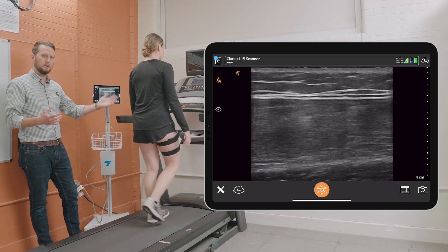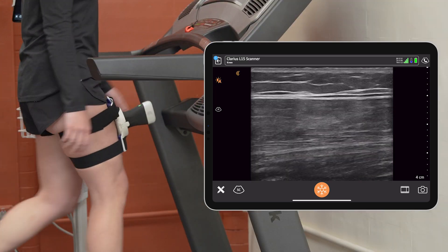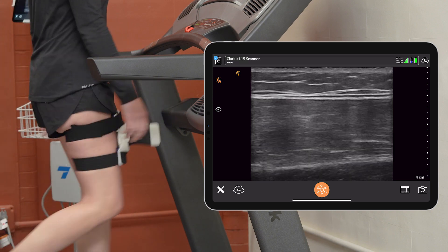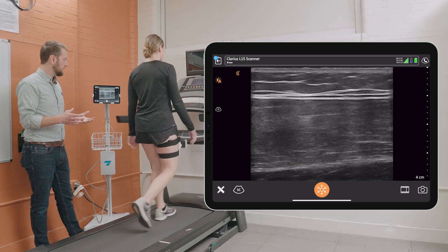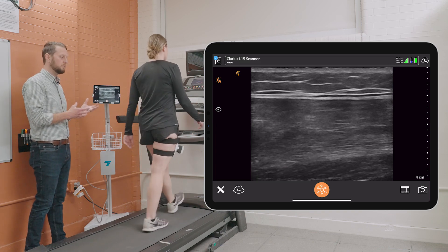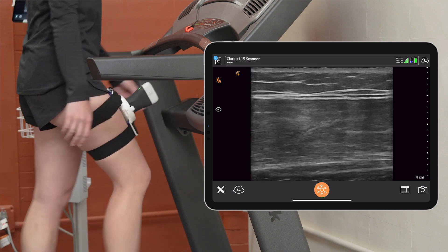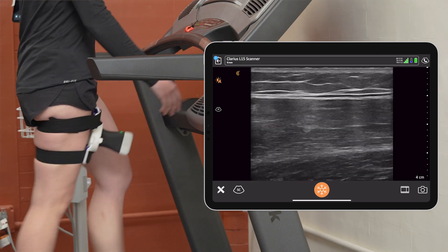We're having her walk on the treadmill, and what you can see in our ultrasound image is again our skin up top, our subcutaneous fat, and then our rectus femoris muscle lying underneath. What we're able to measure in real time is her muscle responding to this walking intervention — we can see how that muscle is contracting and relaxing with each step she takes.